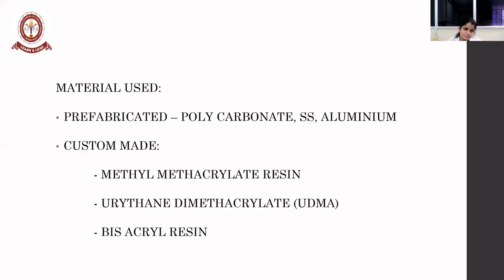Materials which you have used should be biocompatible and wear resistant, as well as aesthetic. An acceptable working time should be there, and all these materials should not irritate the pulp or tissues. This is how it should be done with the help of it.